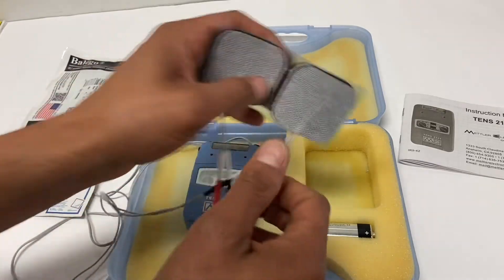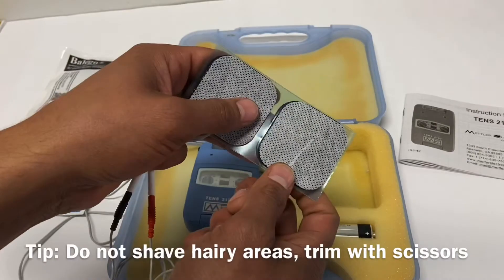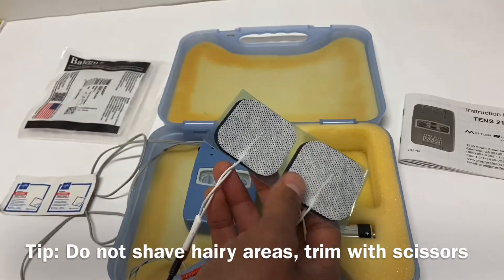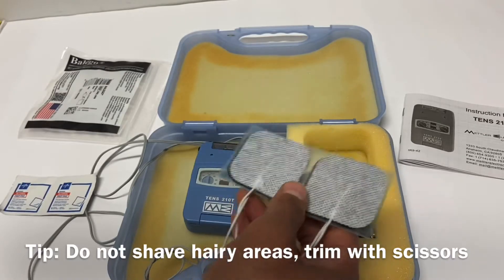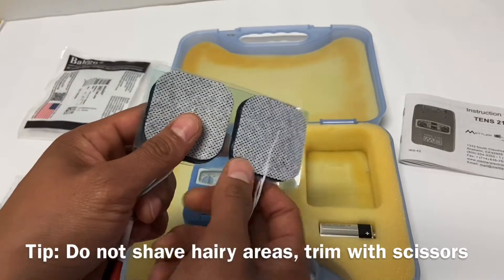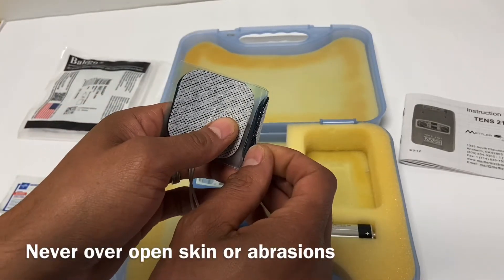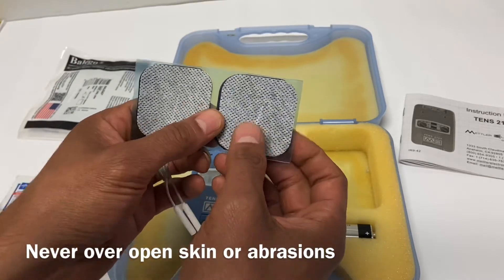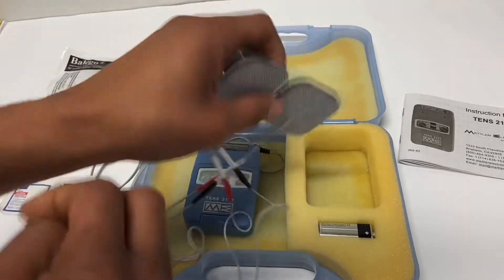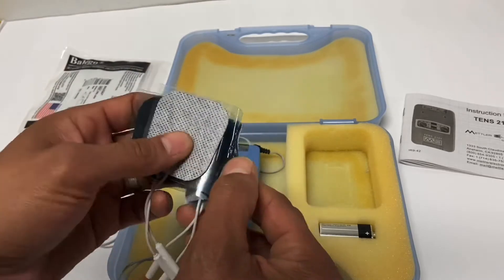If someone is very hairy and you're not getting good contact, do not shave them — that would cause micro-abrasions. Instead, scissor-trim the hair to improve contact. Never place electrodes over abrasions or open skin. If you have trouble getting the pads to stick, you can use athletic wrap tape or a Velcro wrap around them to hold them in place.